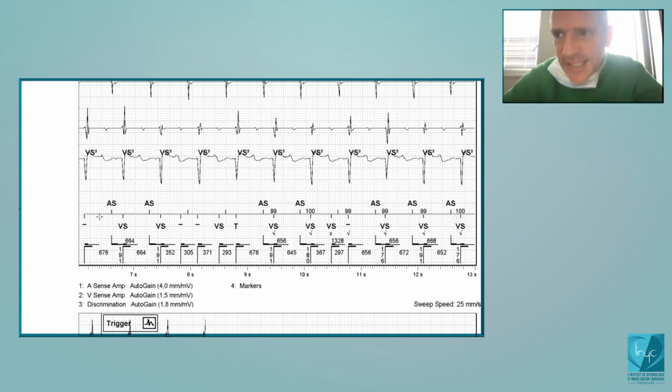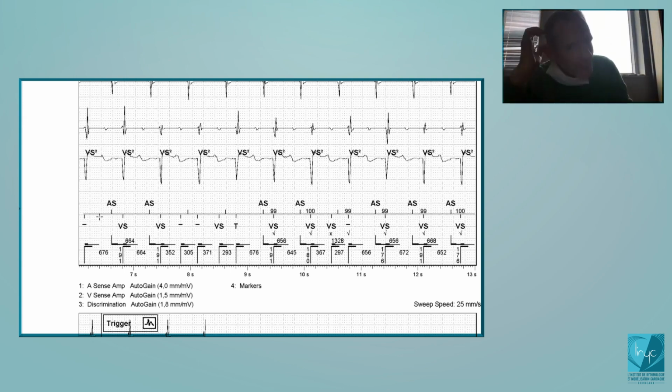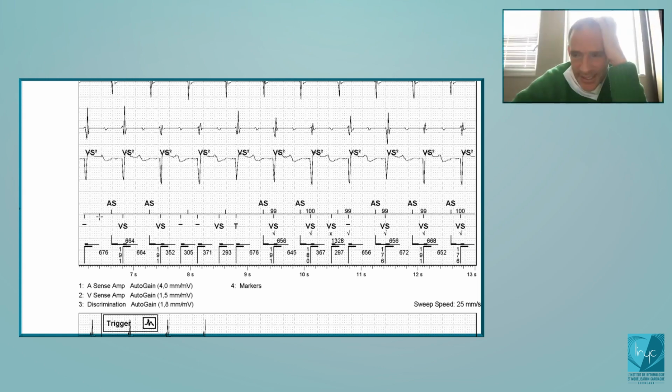That's probably not the case in case of P-wave, so atrial oversensing. So if you oversense the atrium inside the ventricle, most of the time, if your discrimination channel is on coil to CAN, most of the time, if you have P-wave oversensing with bipolar, you also have P-wave oversensing with the coil to CAN, and therefore the risk of inappropriate therapy is still there because you will have a false tachycardia in the bipolar, but also in the discrimination channel. Okay? Are there any questions? That's the basics of how it works.